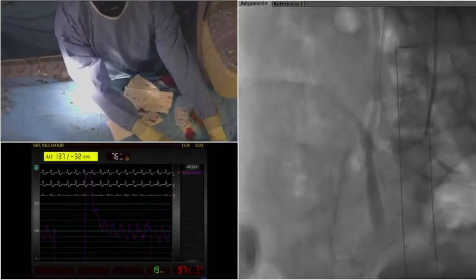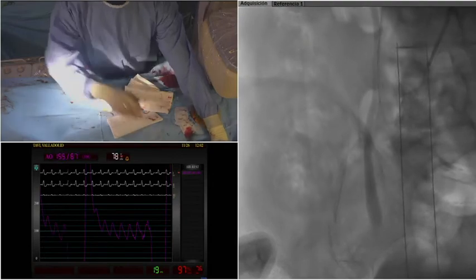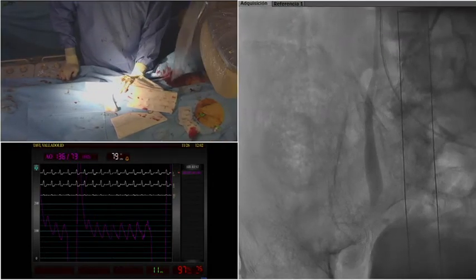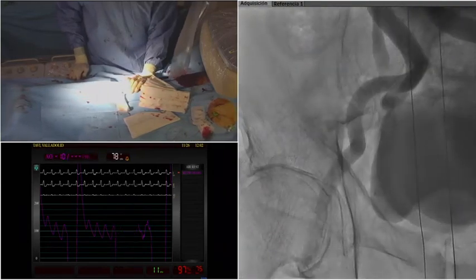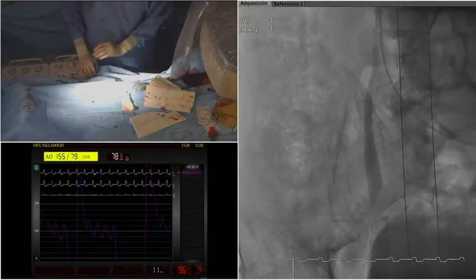Test. Okay. Cine. We see all the length of the vessel in case we have caused a lesion, and you see, we still have to compress, but there is no apparent bleeding.